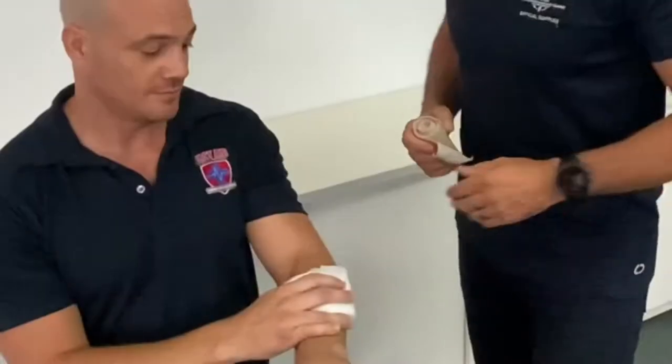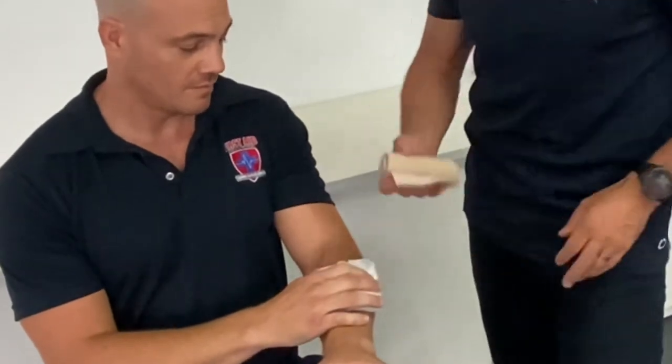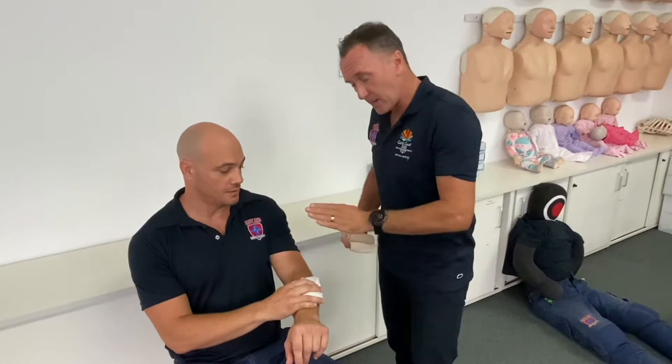G'day, it's Scotty here from First Aid, Accident and Emergency, and today I'm going to give you some bandaging 101, same as what we teach in our first aid courses. With any kind of wound we like to hold pressure over that wound with a pad of some sort, and then we bring in our compression bandage. I'm going to give you a tip on how to get a little bit of extra pressure directly into that spot.